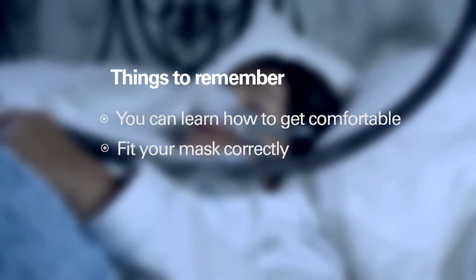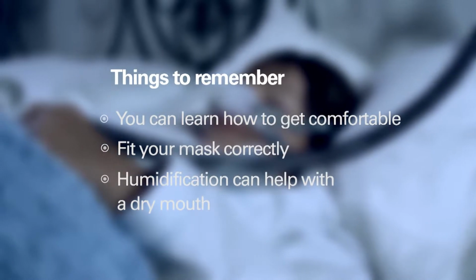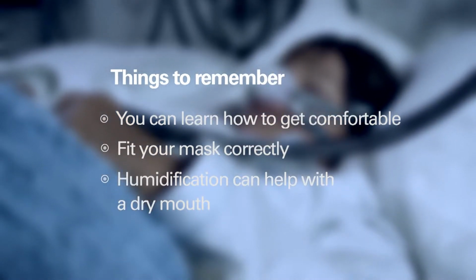If you have a dry mouth or stuffy nose, try adjusting your humidity settings. Find out what works for you. Let yourself experiment with different sleeping and tubing positions. Soon enough, you'll know exactly what you need for a comfortable night's sleep.